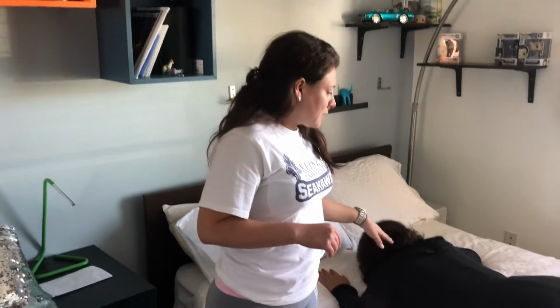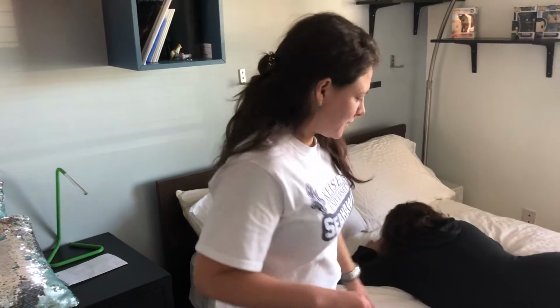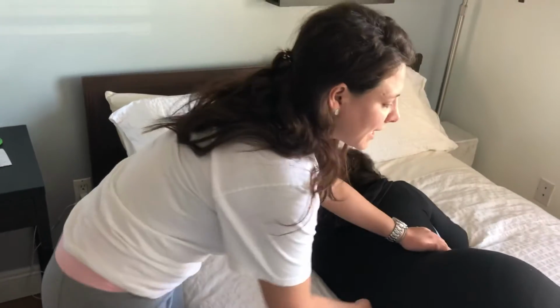The other position that is done for the barium enema. An important fact for the barium enema is that the enema bag cannot be above 24 inches. The first position is the Sims position, just like she is. She's gonna be in a slight LAO.